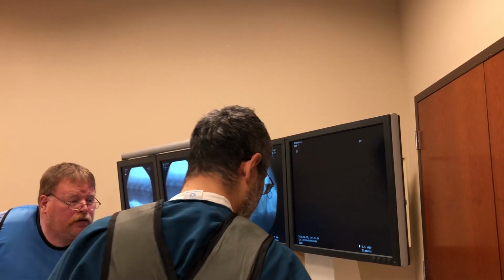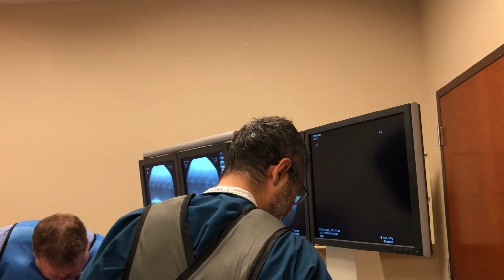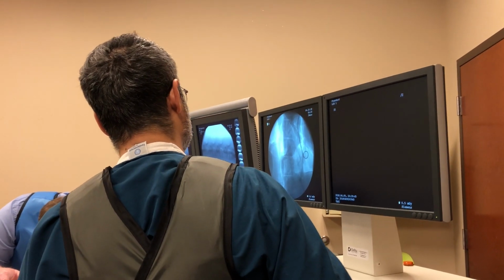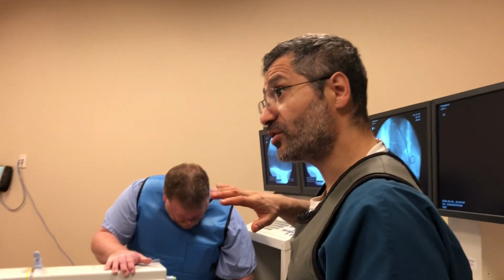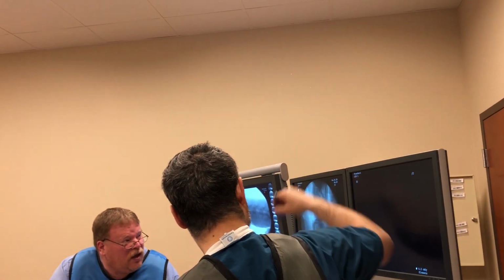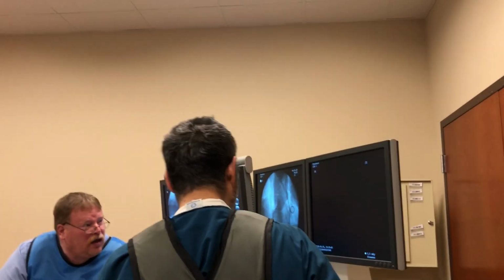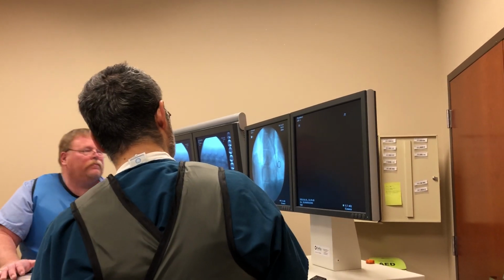Is it somewhere here? Okay, that's okay. For the OLIF part, all you care about is the disc space. No, don't worry about that. That's fine. That was good. Okay, that's good.